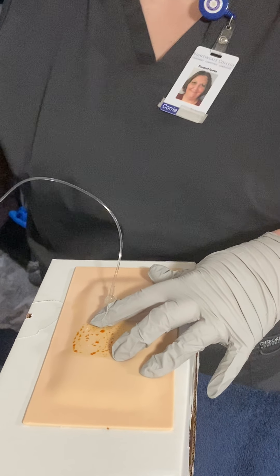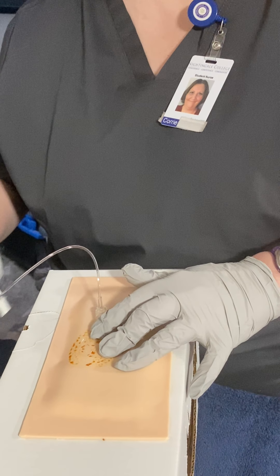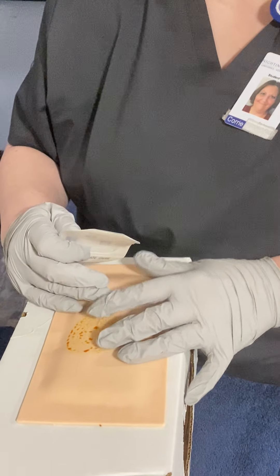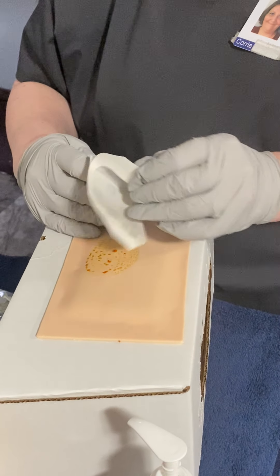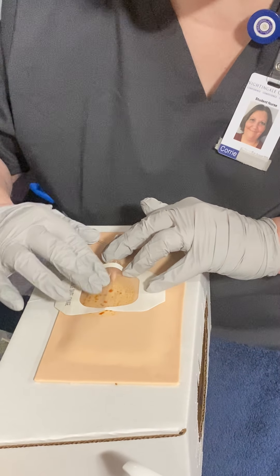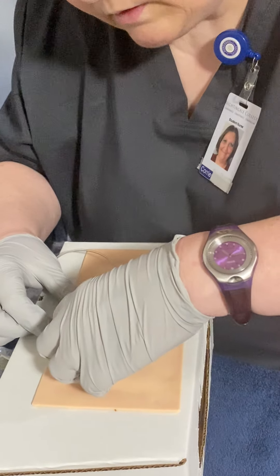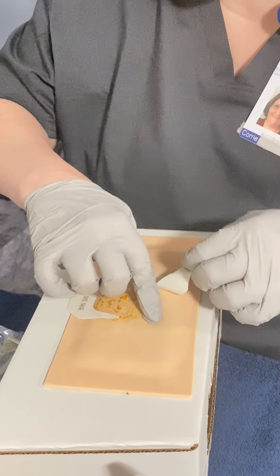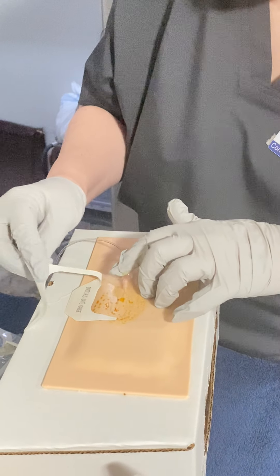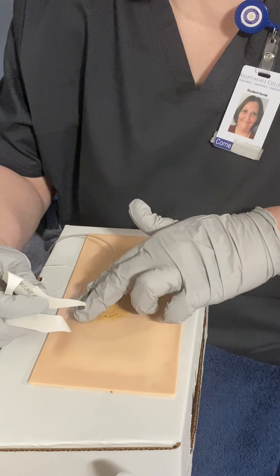I'm going to disconnect my flush and put my bandage on first. This is a clear dressing that I'm going to put on here, and the reason it's clear is so that I can make sure there's nothing wrong with the IV at any time that I need to look at it. This dressing also contains a little piece that you put on the dressing itself that gives you the ability to put your initials, the date it was put in so you know when it's time to redo it, and the gauge of the needle, which is a 20 gauge.